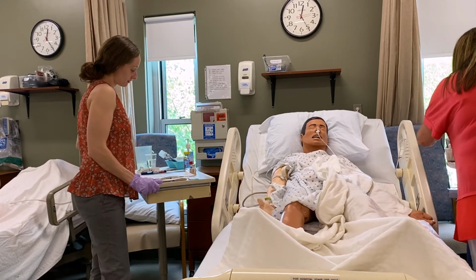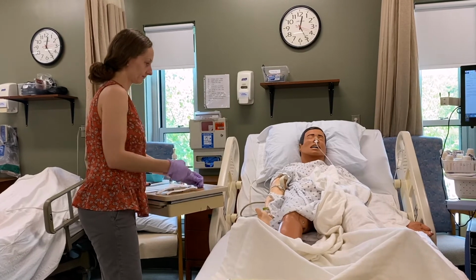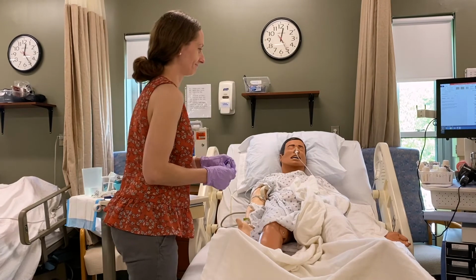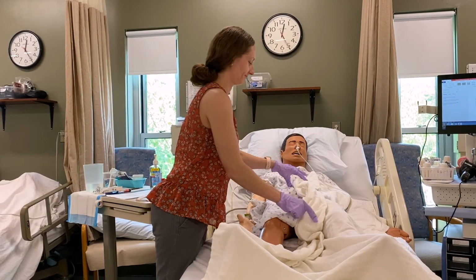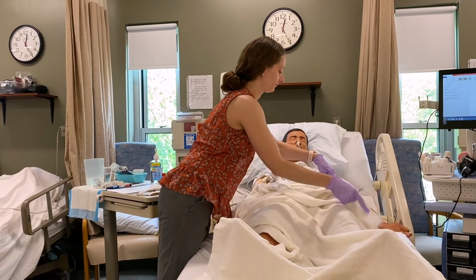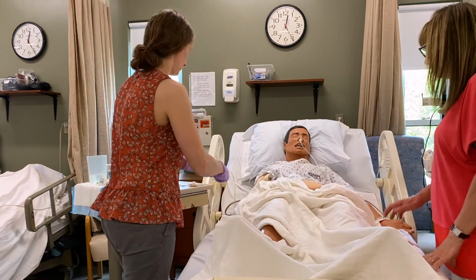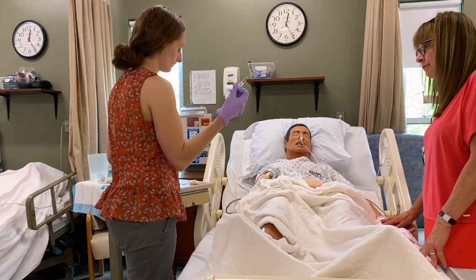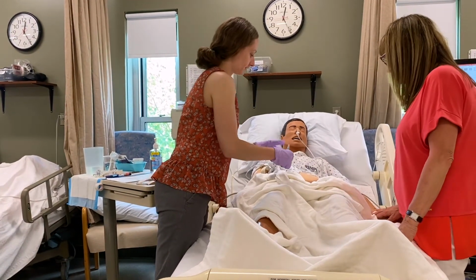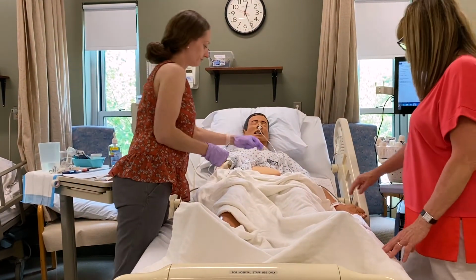Have your Lovenox. Some gauze. And you've done some gauze, okay? Okay. Here's some gauze. And double check this against my mark. 0.4, right? 0.4. Okay. I'm going to put this in the abdomen for best absorption. 2 inches around the umbilicus.